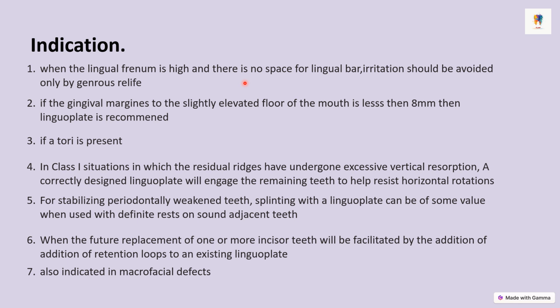If the gingival margin is slightly elevated and the floor of the mouth is less than 8 millimeters, then the lingual plate is recommended. So when there is not a distance of 8 between the gingival margins of the natural teeth and the floor of the mouth, then you give a lingual plate. If a tori is present, you don't go for a lingual bar, you have to go for a lingual plate.